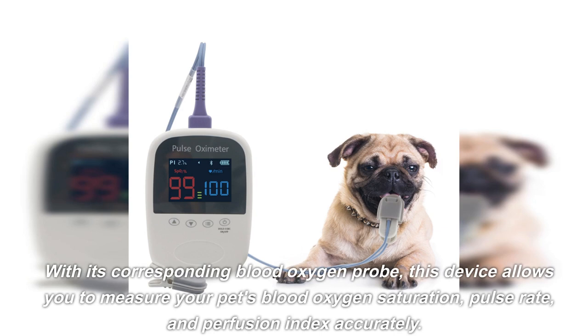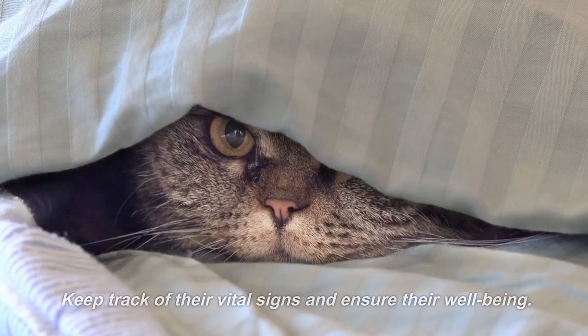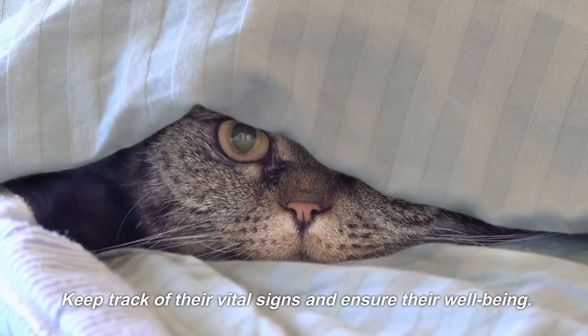With its corresponding blood oxygen probe, this device allows you to measure your pet's blood oxygen saturation, pulse rate, and perfusion index accurately. Keep track of their vital signs and ensure their well-being.